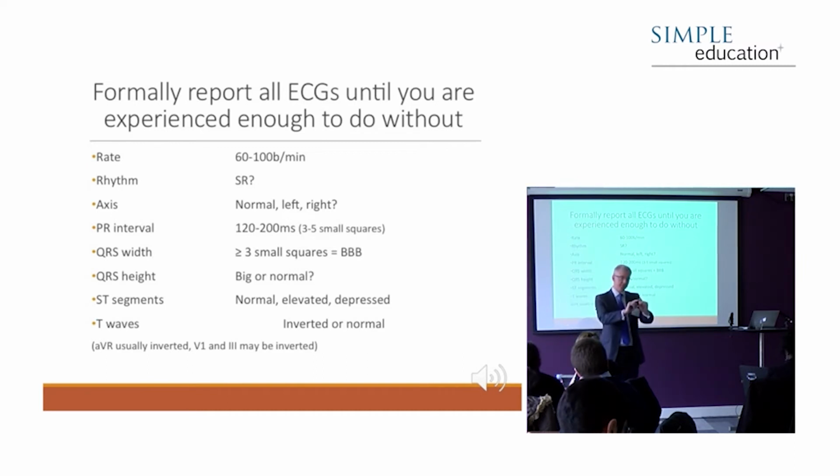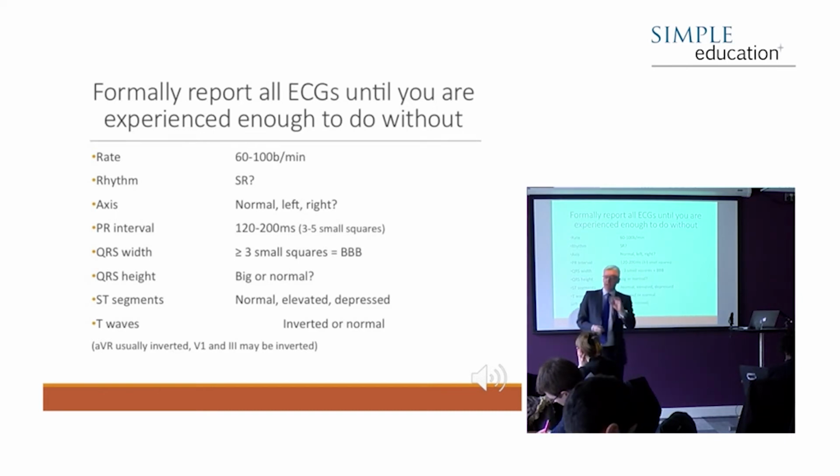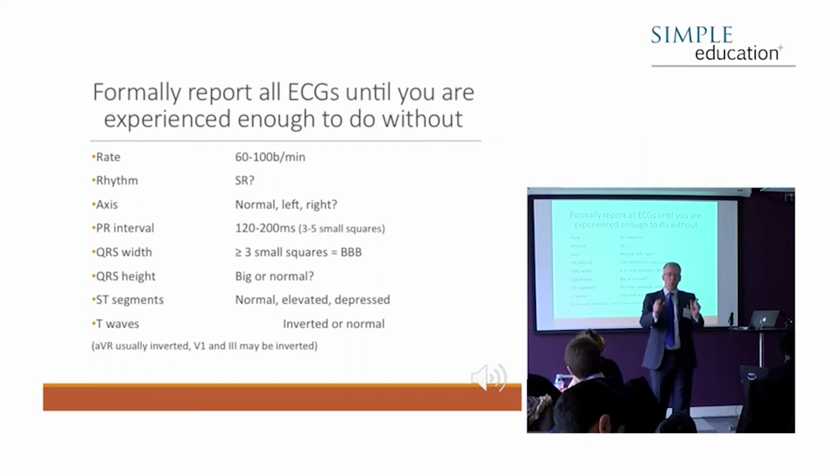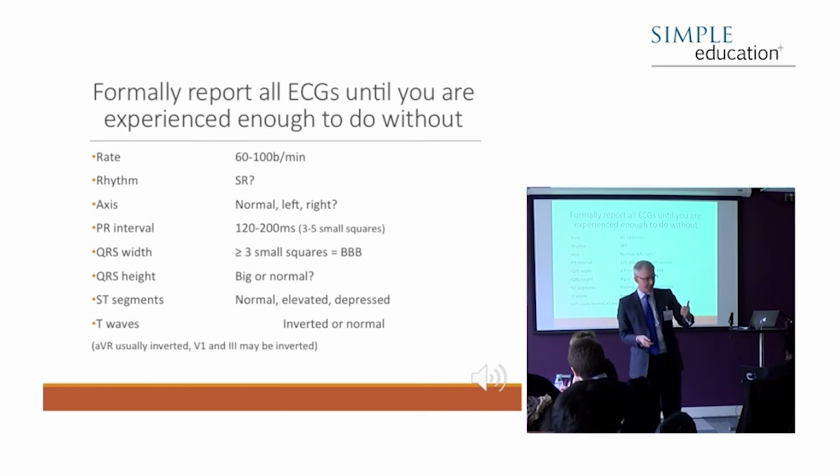That's why the ECG computer defaults to that as the rhythm strip. Your purpose of using that is to identify, is it sinus rhythm? Is there one P wave to one QRS in a one-to-one predictable fashion? There's no extra P waves, there's no variation in the rate, there's no variation in the relationship. Sinus rhythm's the first one you want to identify.